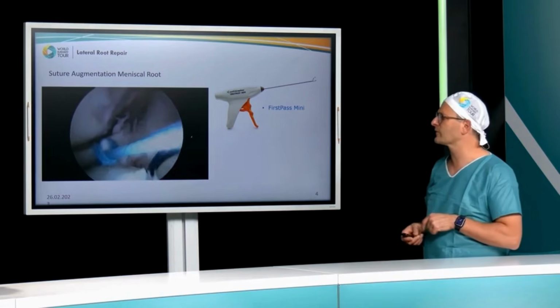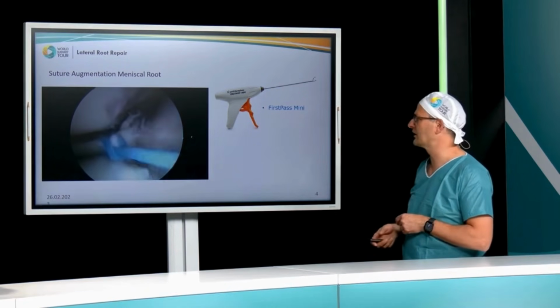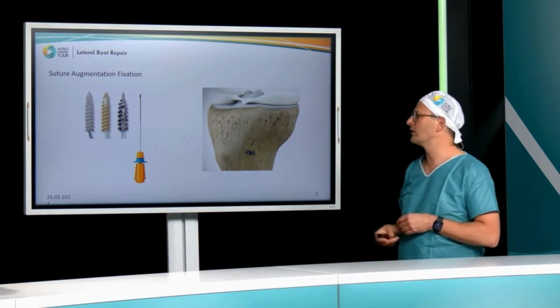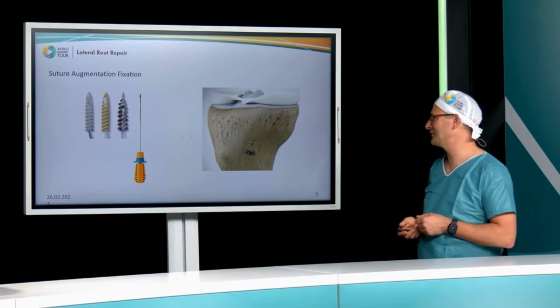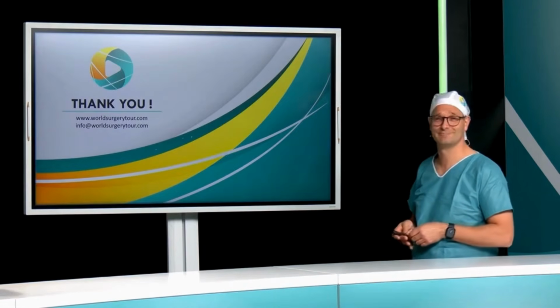Here you see the tape. It's an ultrabraid tape, which is then going to be pulled through the tibial tunnel. And finally, there's going to be a fixation to the tibial cortex, which can either be done by a button or an anchor. Some people even suggest just tying it to the augmented sutures of the tibial ACL part. So that's pretty much what we're planning to do.